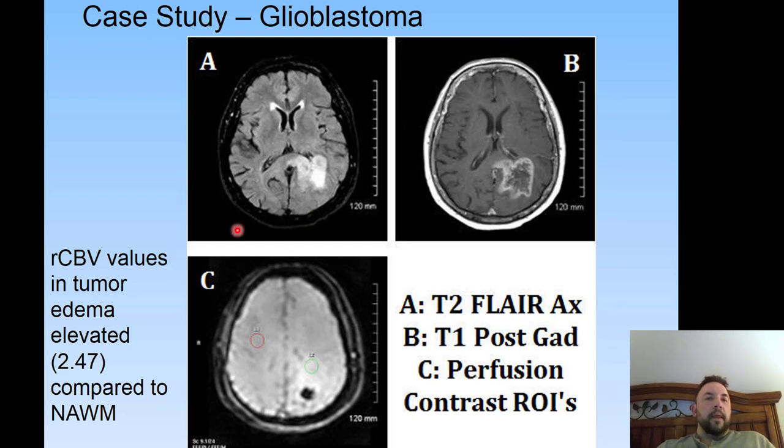In a case study here, a patient came in, she just had some dizziness and some minor symptoms, and you find all this tumor effect. We know that they're going to want to do something as far as a surgical intervention quite rapidly, and our doctors made the decision to perform the MR perfusion on the spot. So here you have tumor effect, enhancement to it, but when you inject the contrast rapidly, you see the area of the bloody component of the tumor. But more importantly, here in this region, we establish the perfusion in the actual edema of the tumor itself, not in the actual mass, as compared to normal white matter.